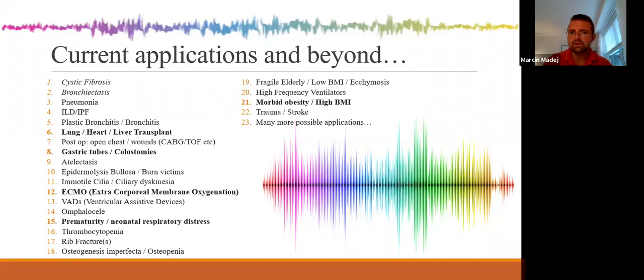Thank you, Michael. I think, again, in that particular aspect, Mike really gave a very interesting point, specifically when children are on those oscillators. It's high risk to move those patients. So any additional movement for them can potentially dislodge that tube, etc. But with the frequencer, I could utilize it in any position. The patient can be prone.